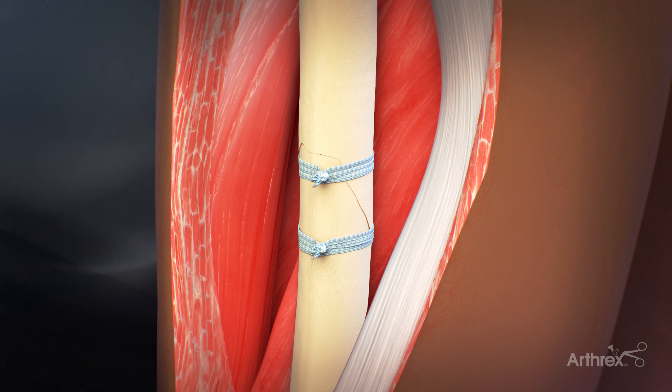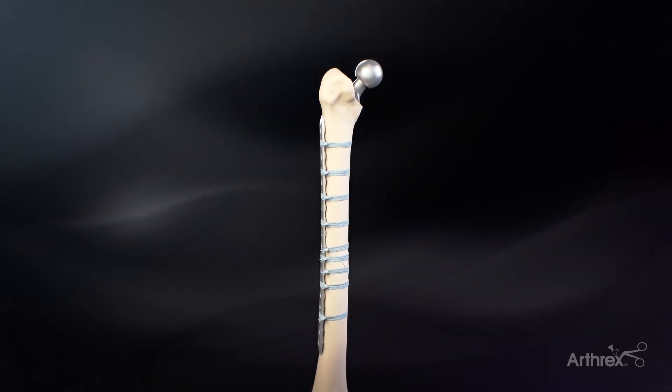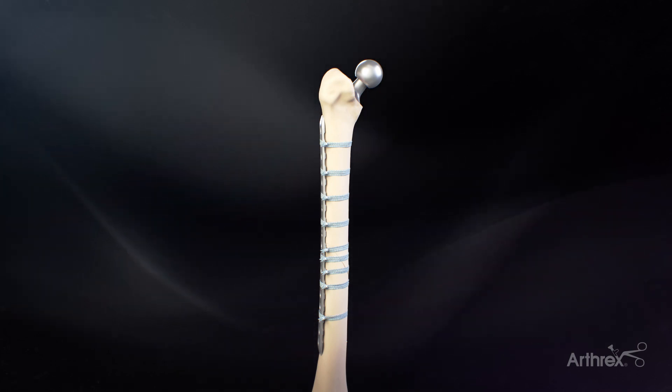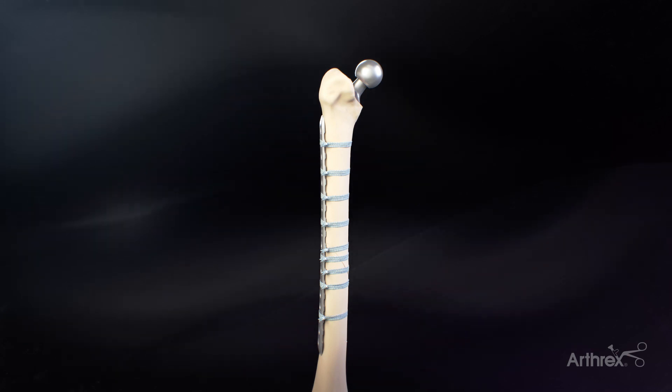After the fiber tape cerclage is used to reduce the fracture, a fracture plate may be placed directly over the fiber tape cerclage. If necessary, the fiber tape cerclage may also be used to support fixation of the plate in areas where screws cannot be placed, or where additional compression is needed to aid in stabilization and fracture healing.